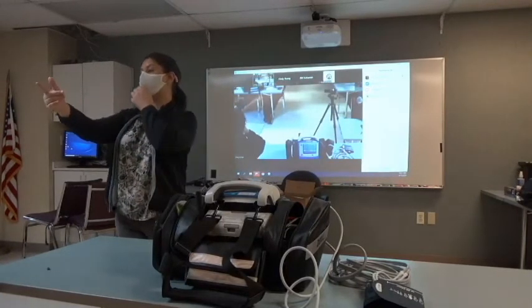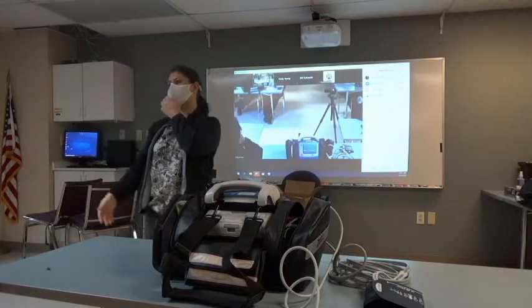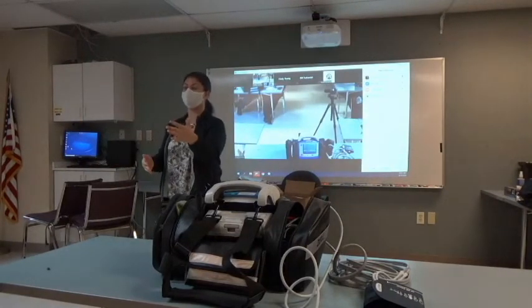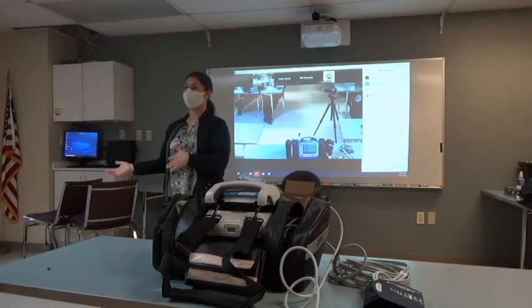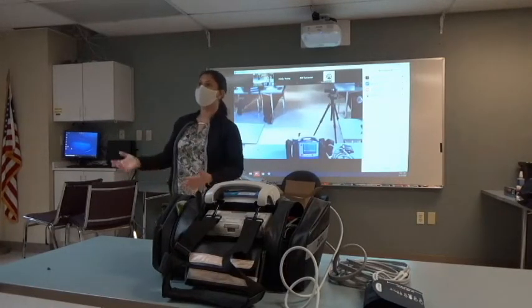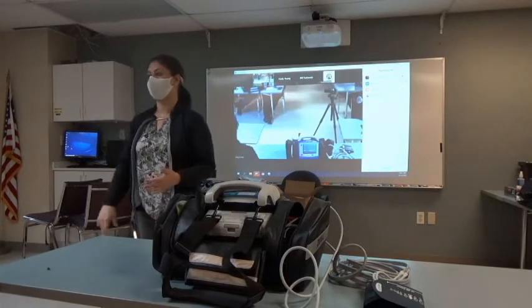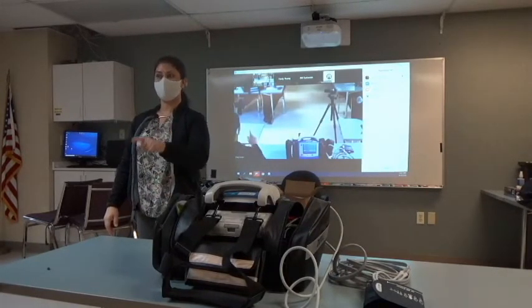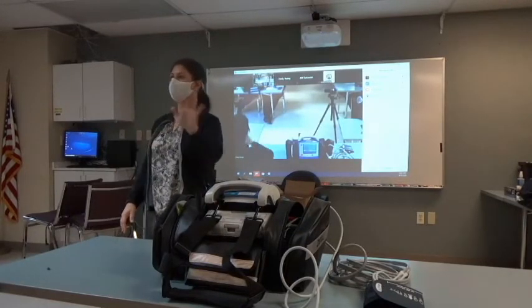Physio's biphasic go up to 360 as well. It just depends. Some biphasic goes up to 360, some go up to 200. This is dependent on our waveform, so this is proprietary. This waveform is different. Okay? You guys are currently using 200 though with your Philips. Yes. So it's the same thing, 200.